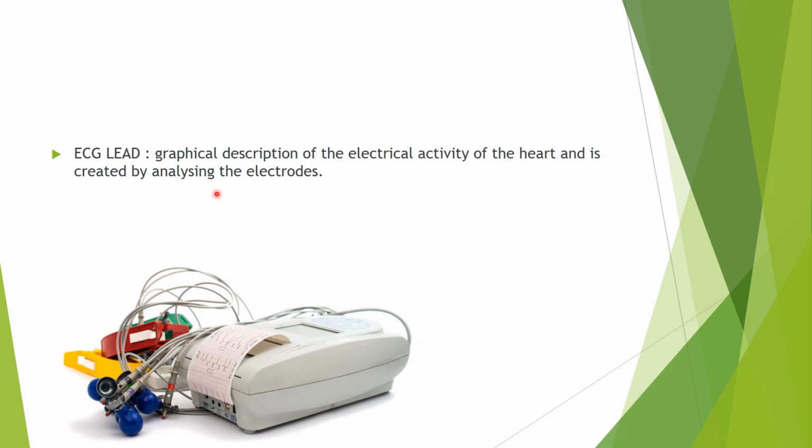An ECG lead is a graphical representation of the electrical activity of the heart, and it is created by analyzing the electrodes. So an ECG lead is a graphical representation of the heart's electrical activity which is calculated by analyzing data from several ECG electrodes.